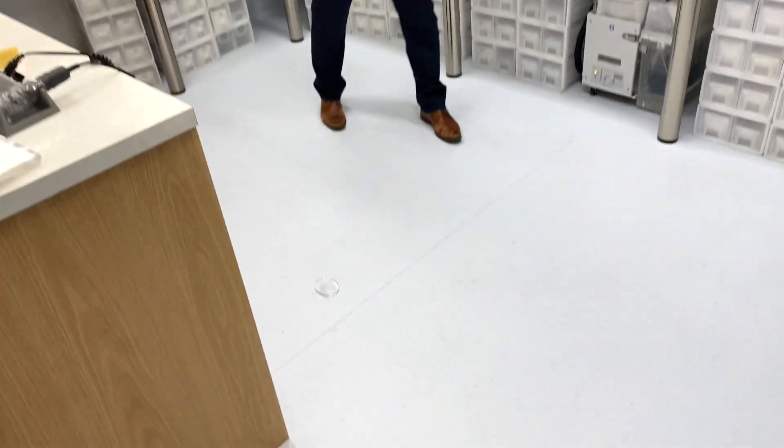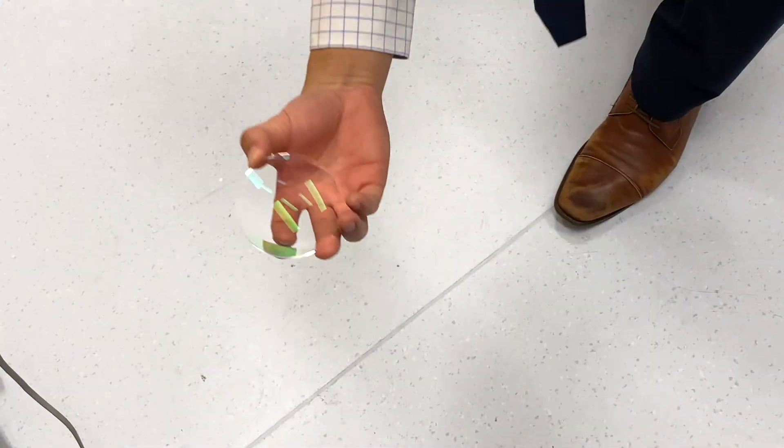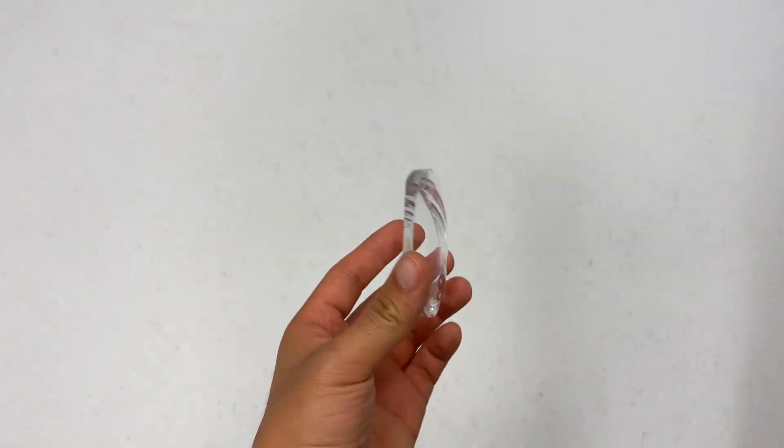Dr. Steve asks whether the lens would break if thrown on the ground, and Rachel says to give it a try. He smashes the lenses on the ground and they come out in one piece — they didn't break. This confirms that the lenses don't break after being smashed on the ground because they're really strong plastic.